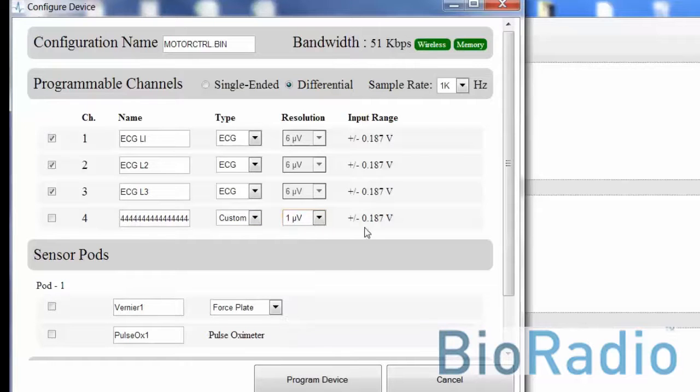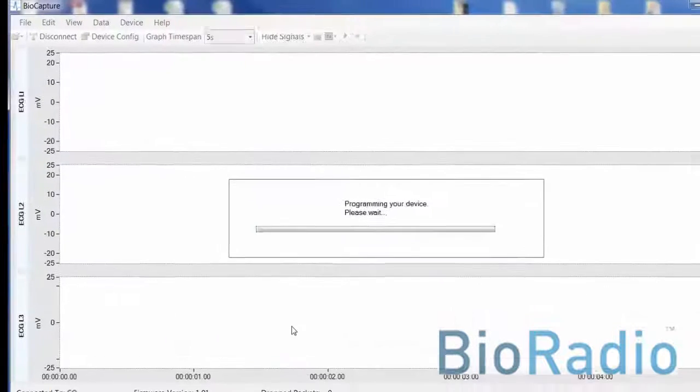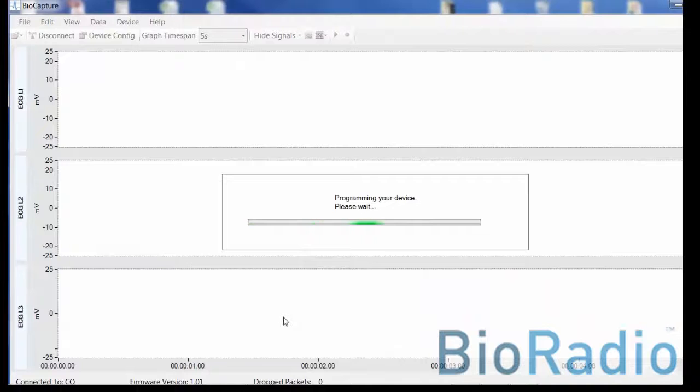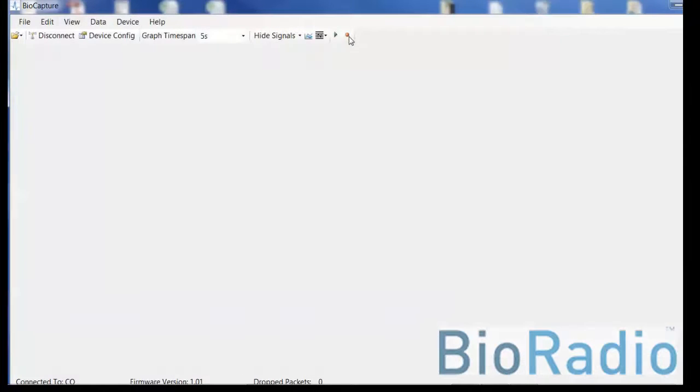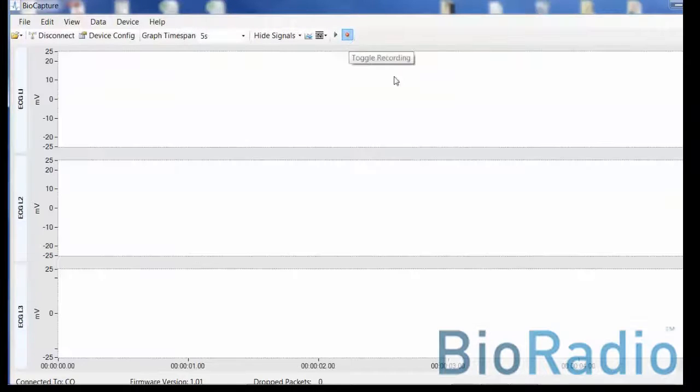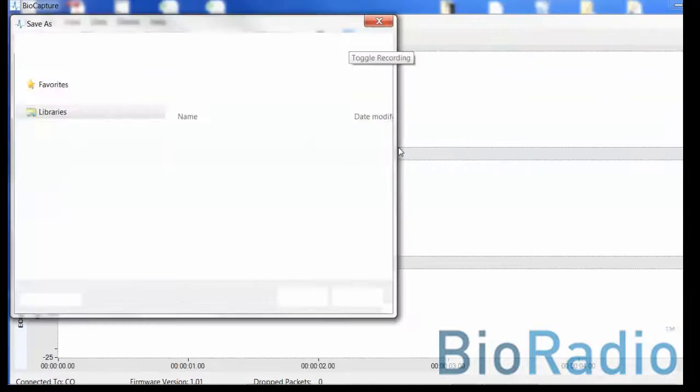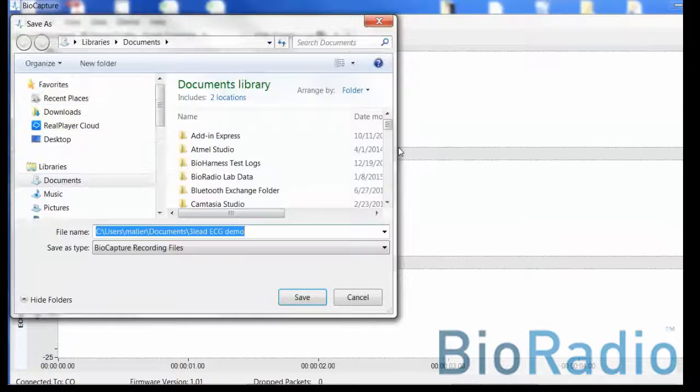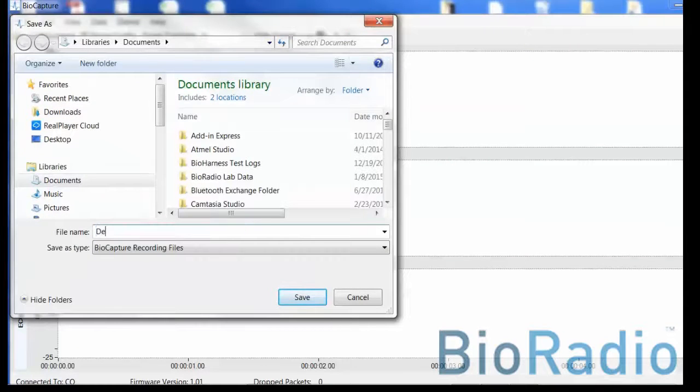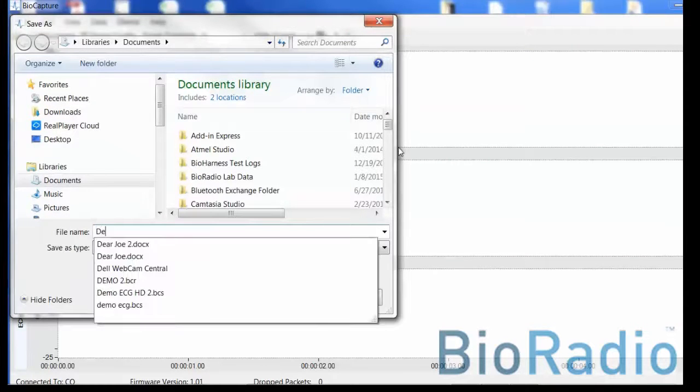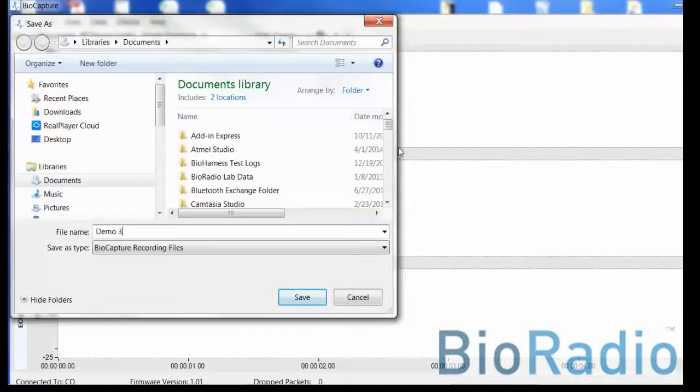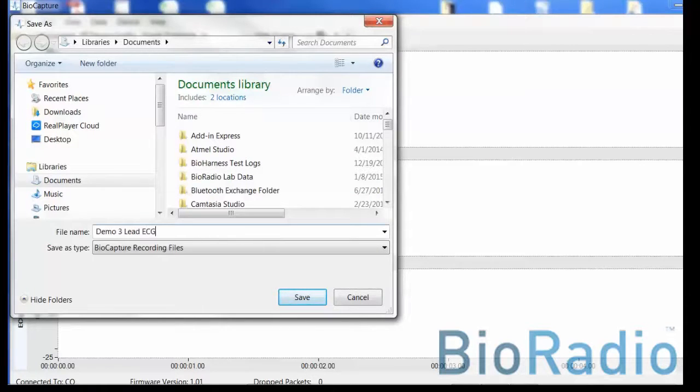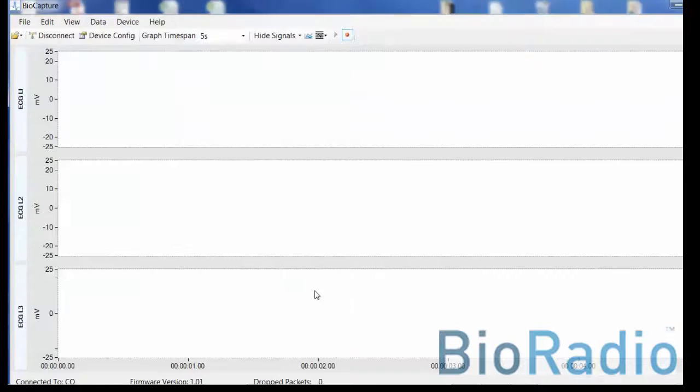You can customize a channel by programming the resolution rates. Once you've programmed the device, hit program the device and select the record option. Provide the name of the file along with the location of the file that you choose to record and then save.